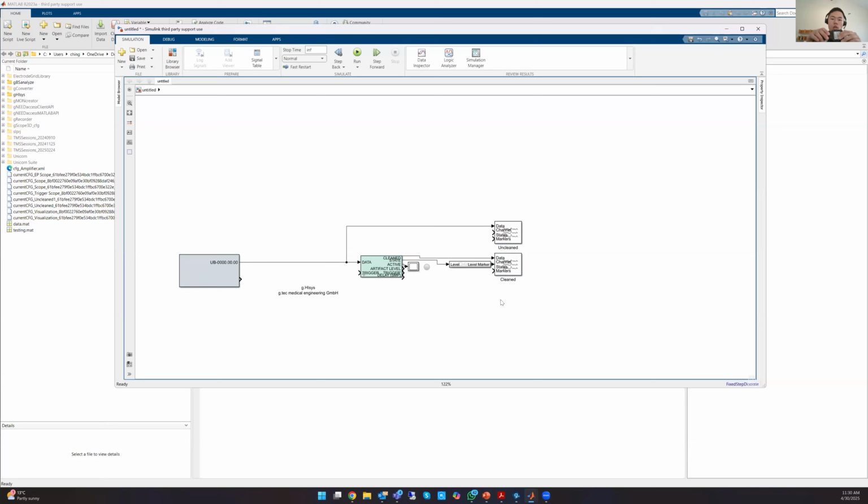The first thing I need to do is to mount the cap and connect the device. This is the receiver end with a USB cable. This is the transmitter amplifier, which automatically pairs with the device itself. So first thing, I will plug in this device for the transmitter. Then on the transmitter and the Nautilus itself, press and hold the power button. Then you see a light blinking when it is stabilized, which means it has already paired with the receiver end.